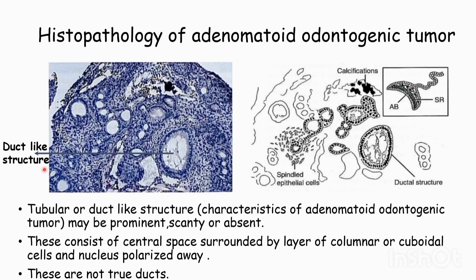Tubular or duct-like structures may be prominently seen in Adenomatoid Odontogenic Tumor, or may be scanty or even absent in some cases. These consist of a central space surrounded by a layer of columnar or cuboidal cells where the nucleus is polarized away from it. These are not true ducts.